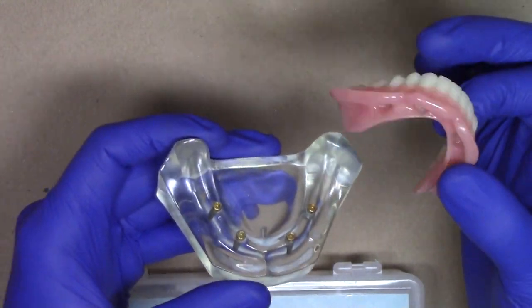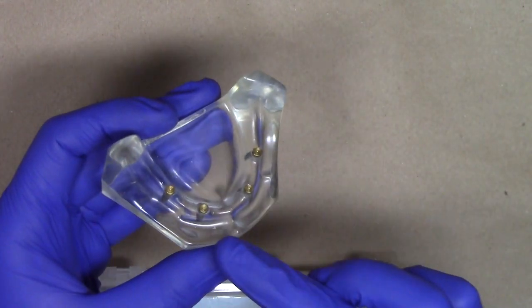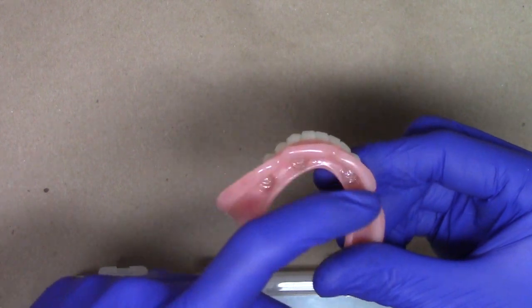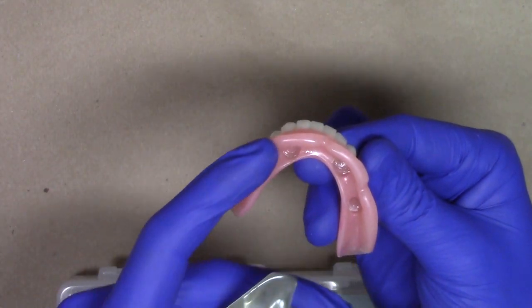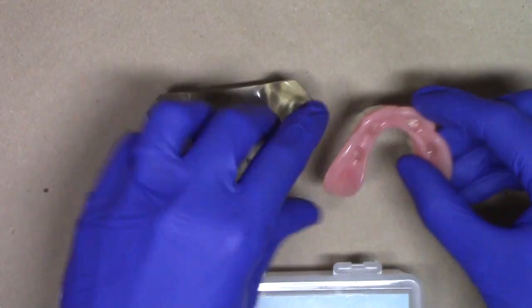But if you remember, and you can review some of my other videos, I just take a little bit of the Zest CHAIRSIDE bite registration material, place it on the inside of the denture, and seat it in the mouth until you get a few marks on the underside of the denture. I've already gone ahead and created those holes.